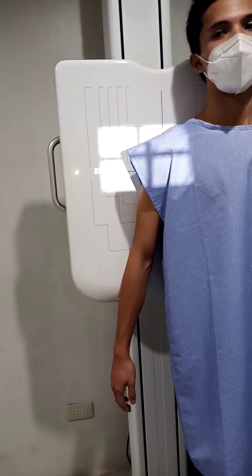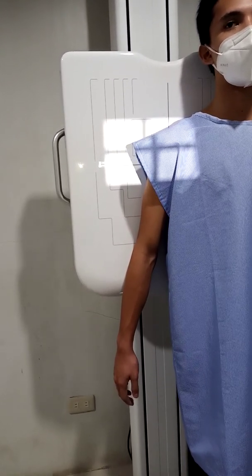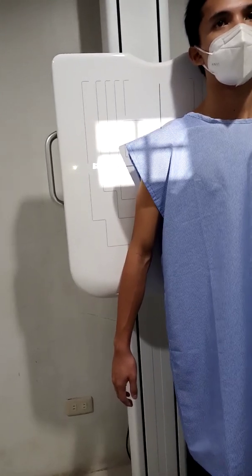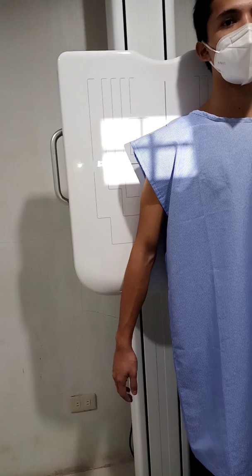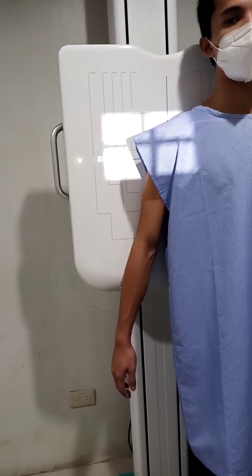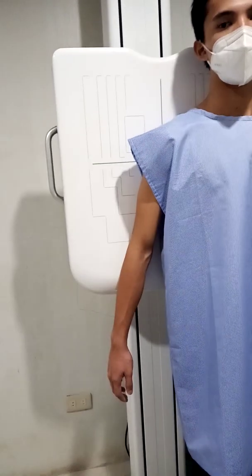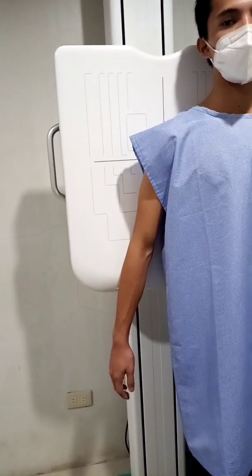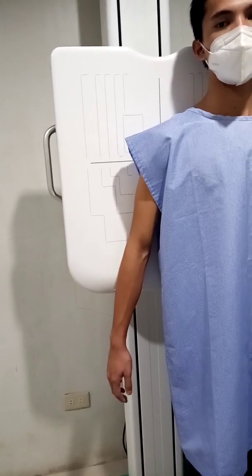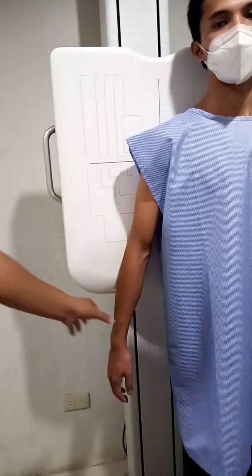And so there were three hand positions and their effect on the proximal humerus. Again, there are three hand positions and their effect on the proximal humerus. First is, if you're going to instruct the patient to supinate his hand, it will position the humerus in external rotation.